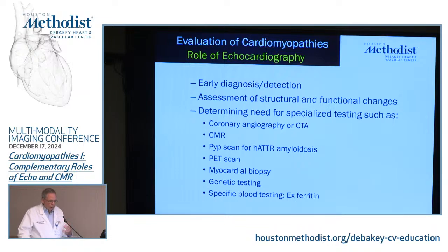So the role of echocardiography really is in the forefront, that early detection, because usually echo is the very first test that somebody has after an EKG, and then something comes up as a finding in the echo that suggests there's a cardiomyopathy, and then the role of echo is early diagnosis and detection, look at structural and functional changes, right? That's where we have the diastology part, looking at cardiac output, looking at filling pressures, pulmonary pressures, and so on. Structural changes, how big is the LV, how much hypertrophy, ejection fraction, strain, which we discussed previously.